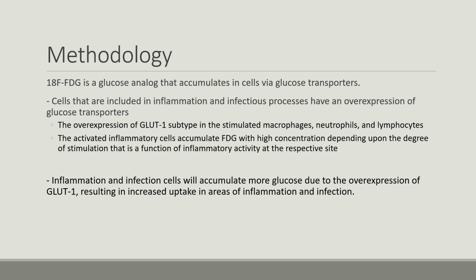Inflammation and infection cells will accumulate more glucose due to the overexpression of GLUT1, resulting in increased uptake in areas of inflammation and infection.